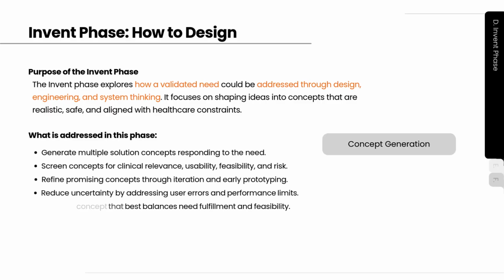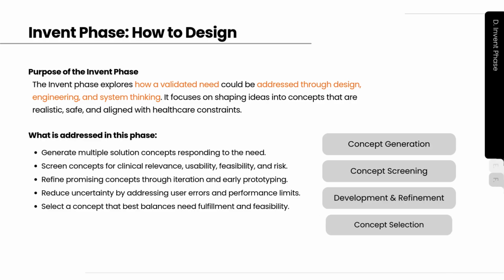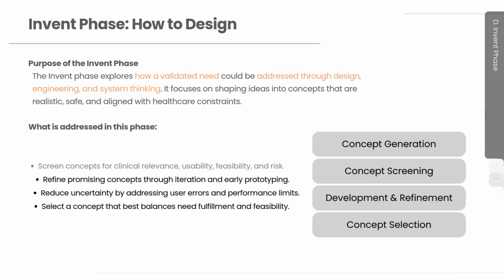This phase focuses on turning insights into multiple solution concepts, then screening them for clinical relevance, usability, feasibility, and risk. Through early prototyping and iteration, uncertainty is reduced, allowing the team to refine and ultimately select a concept that best balances user needs with real healthcare constraints.